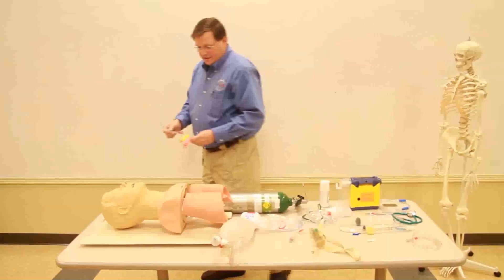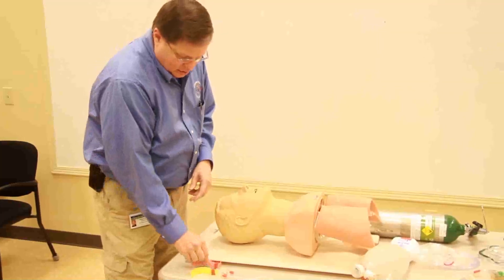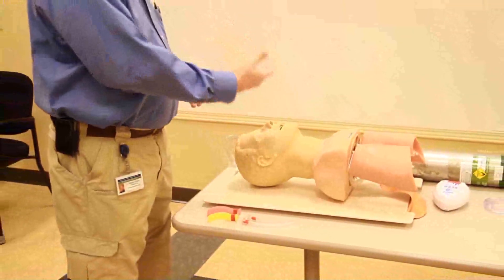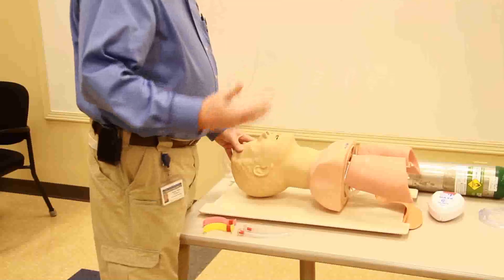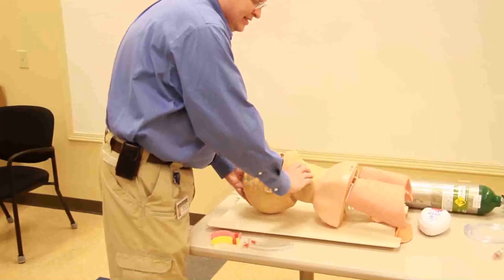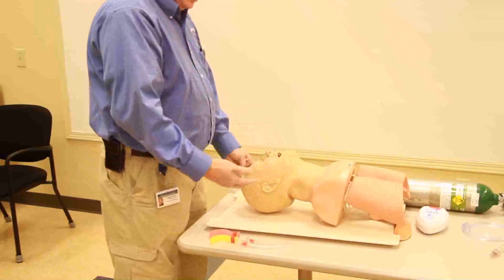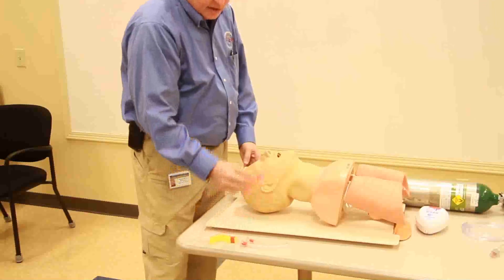We're going to move to our mannequin and place the oropharyngeal airway. First, we want to make sure we have BSI and that our patient is breathing and has a heart rate. We approach the patient and shake and shout: 'Sir, are you okay? Are you alright?' If there's no response, we check for a pulse and simultaneously open the airway. The patient has a pulse, so now we look and listen for signs of breathing. If the patient is breathing but still has an airway problem, we attempt to place an oropharyngeal airway.